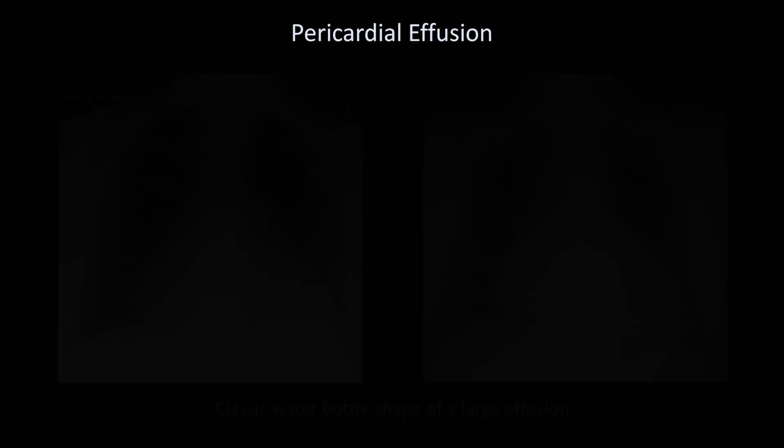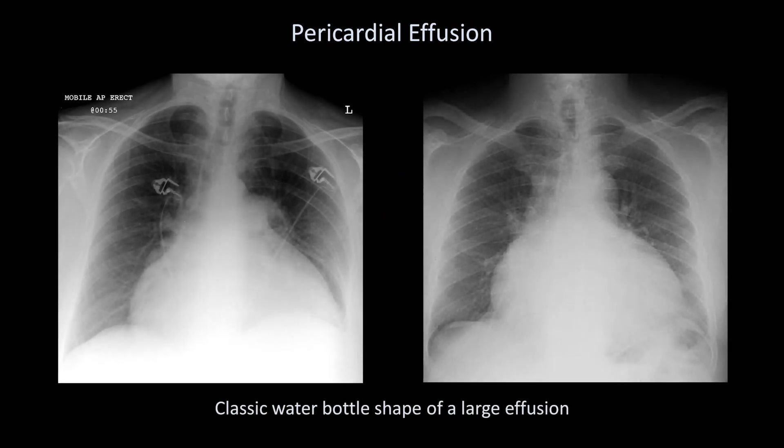Here are two examples of the water bottle shape of a very large pericardial effusion. You may be wondering how these look like water bottles, but the name was given when water bottles weren't made out of aluminum or rigid plastic, but rather soft-sided materials like leather.